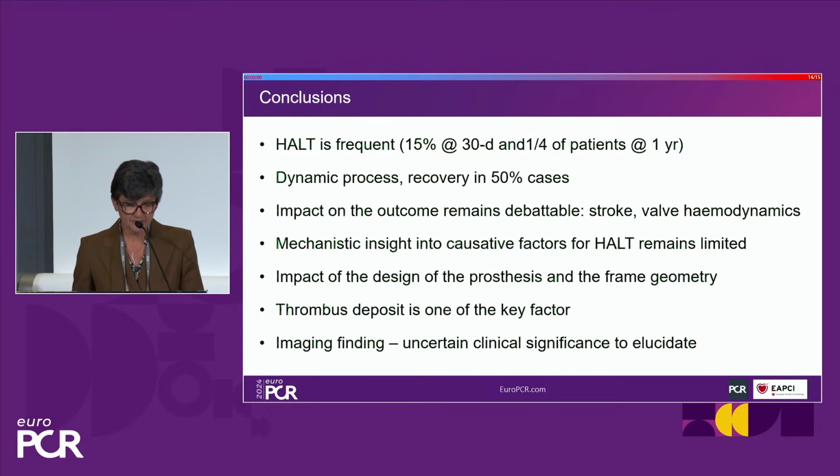It seems that there is an impact of the design of the prosthesis and the frame geometry on the occurrence of HALT. For sure, thrombus deposit is one of the key factors of the phenomenon. HALT is still today an imaging finding with an uncertain clinical significance, but we should elucidate it, and this is the reason why we should continue to be busy with this phenomenon and to have a good understanding.